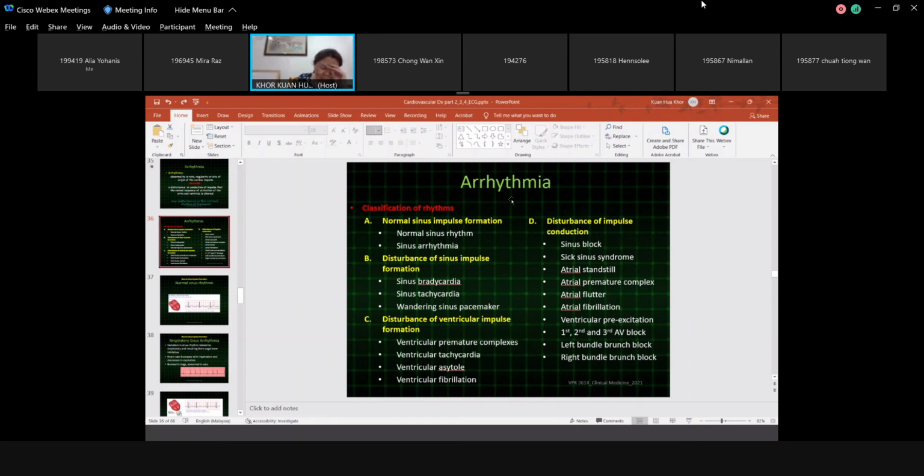What Wan Xing asked: why do you want to make us calculate sinus rhythm and atrial rhythm and ventricular rhythm? That is because a sinus impulse gives you a normal complex.